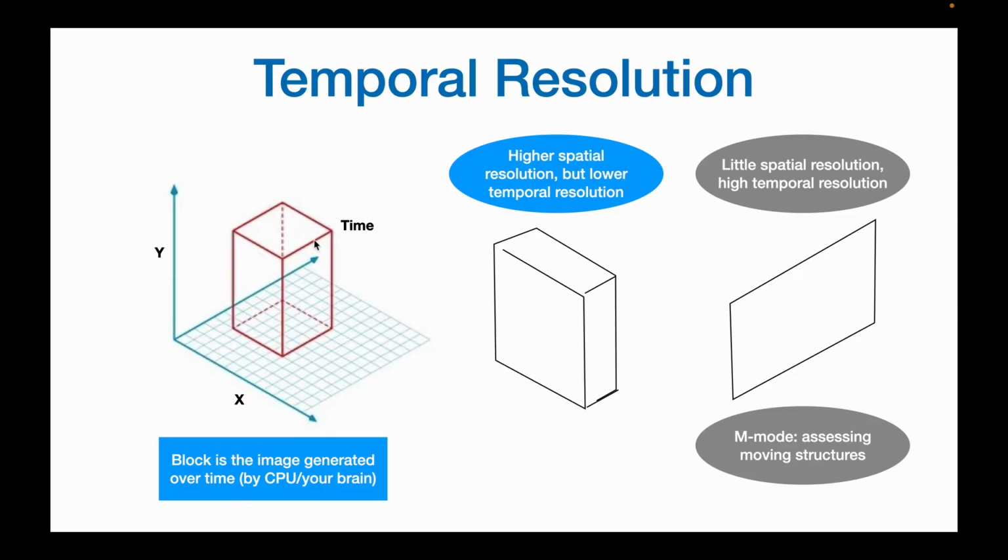For example, this is the cardiac exam right here where you have less resolution devoted to the scan plane, but increased temporal resolution as compared to, let's say, musculoskeletal or small parts presets, which give you better scan plane resolution, but decreased temporal resolution. However, with better technology, the limitation is becoming more of our human ability to discern fine movement.